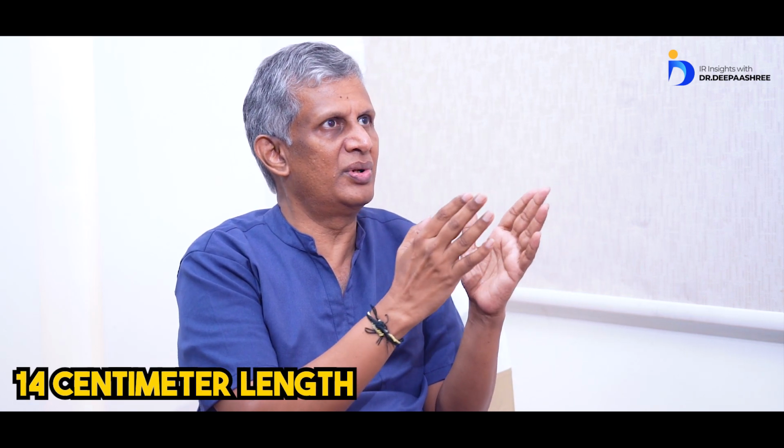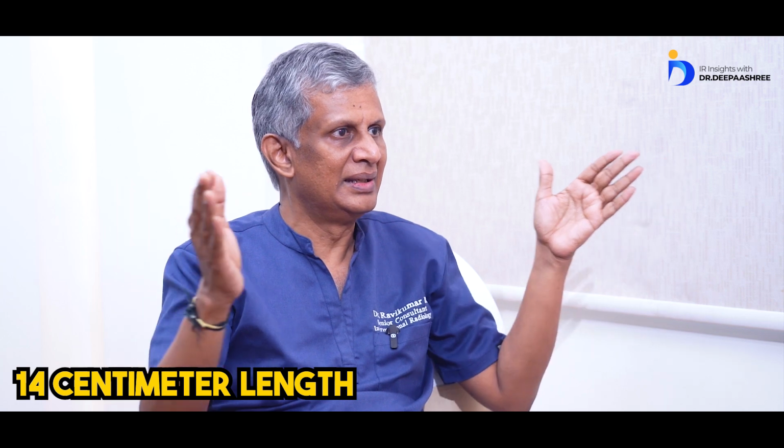When we say 14-3, it's a 14 centimeter length and 3 millimeter diameter. Like that, you've got 7-3, you've got 5-3. So try to choose the first coil carefully. When somebody is deploying, always try to use a smaller one, get the hang of using a coil, and then you start building upon it. Once you're senior, you know what size you want and how to make it.